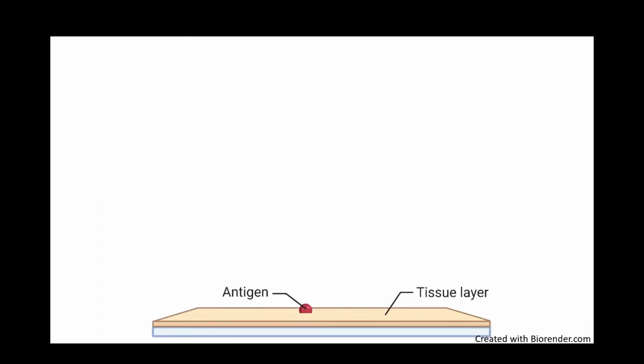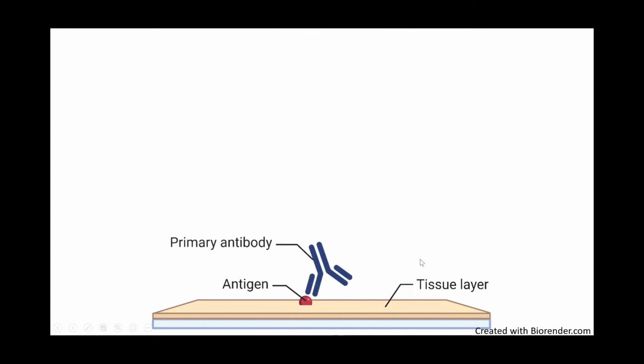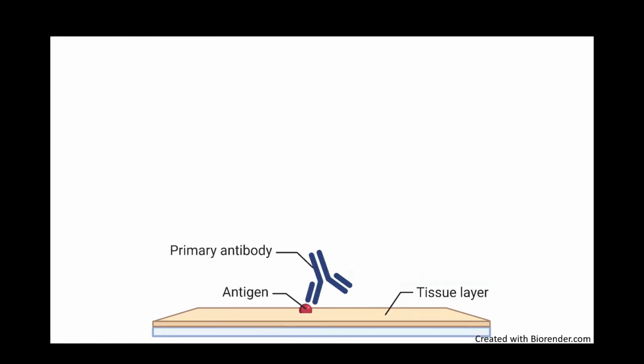When we want to identify where a protein is localized in the tissue and whether its levels change in disease models or in response to treatments, we use a technique called immunohistochemistry. For this, we use antibodies that specifically recognize an antigen that is part of the protein we are interested in. When this so-called primary antibody is bound to the antigen, we add the secondary antibody, which will bind to it.